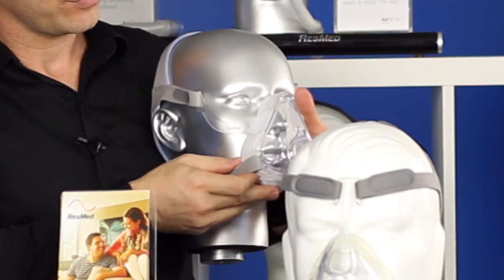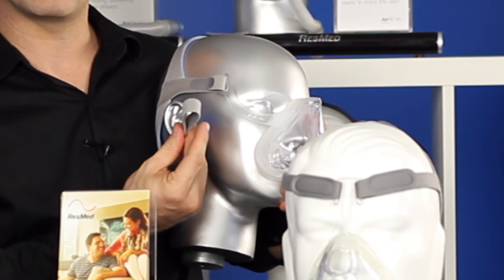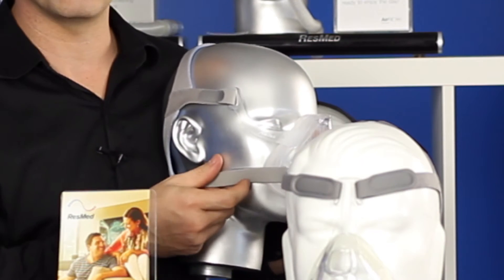They've done away with the clips. We now just unhook the mask, and there's the Velcro adjustments on it there. So we just use our fingers to hook them across.